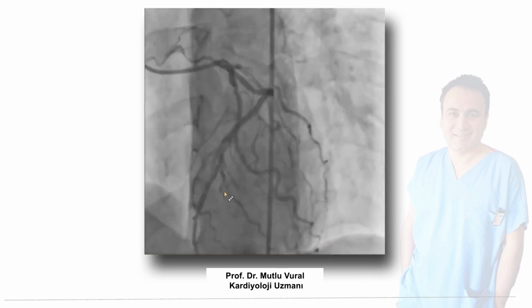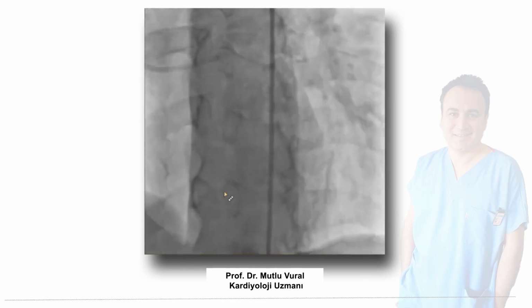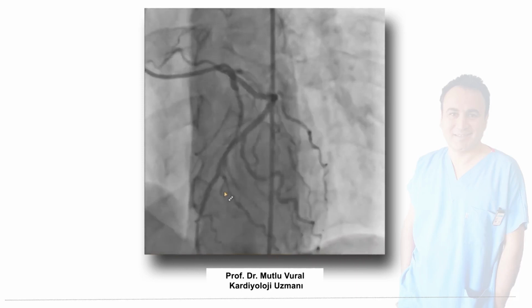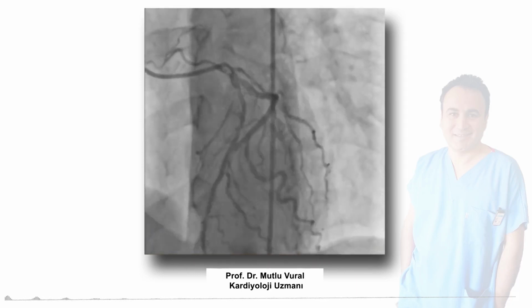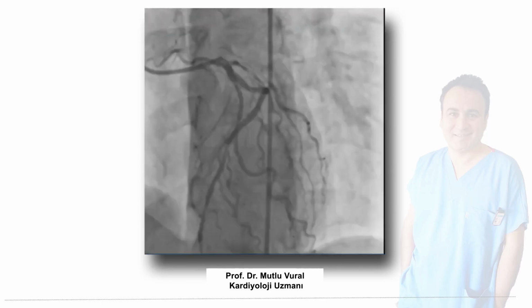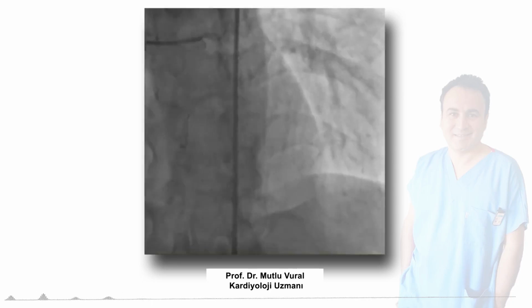We first suspected the septal artery as a guilty lesion, but it was a tiny branch. Now we will check the distal circumflex artery. In the first wiring attempt, it is not a good position.